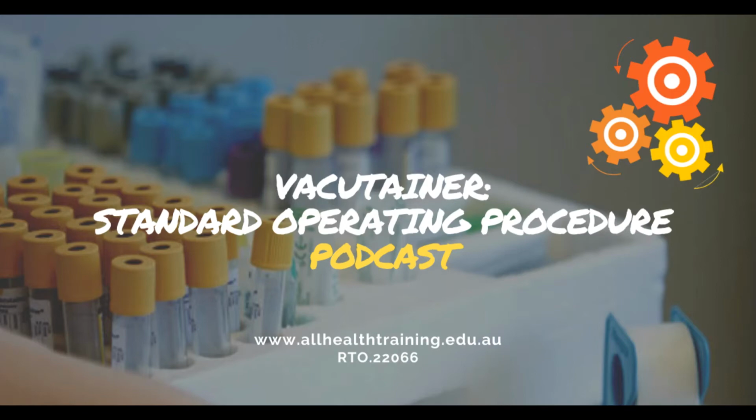With both of these in your hands, twist both ends of the needle until the paper seal is broken and the white cap comes away. Drop this white cap into your kidney dish and immediately screw the exposed end into the small hole of the barrel. Screw this clockwise.